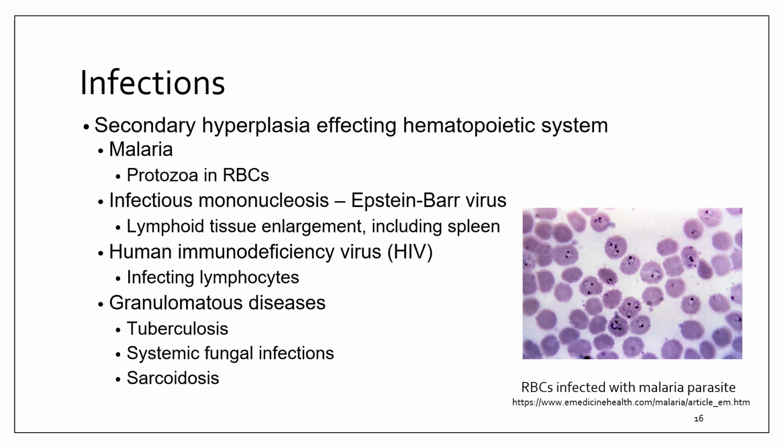On a peripheral smear, you'll often see atypical lymphocytes, large cells with abundant cytoplasm, and cytoplasm that hugs surrounding red blood cells. These are reactive T cells, not malignant ones. It's an important distinction. So reactive does not mean leukemia.